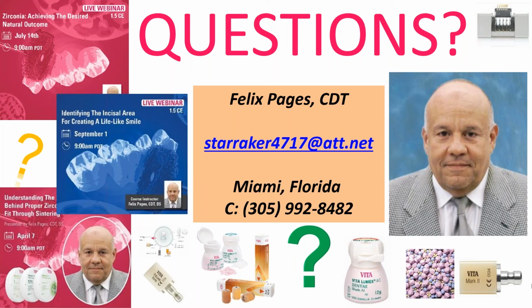resins. Or you could fire a wash of dentine on the inside, like a super thin wash, and etch it. And that way you could bond the zirconia, but it has glass in it. You just need to blast it with like 30 pounds of pressure. You can't use much more. If not, you weaken the zirconia like crazy.